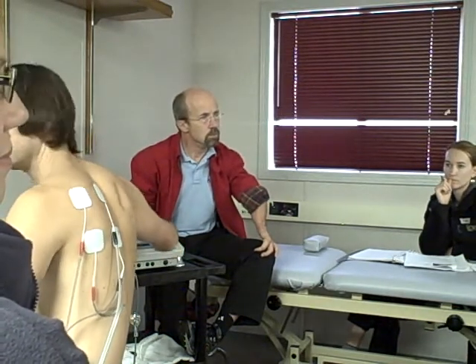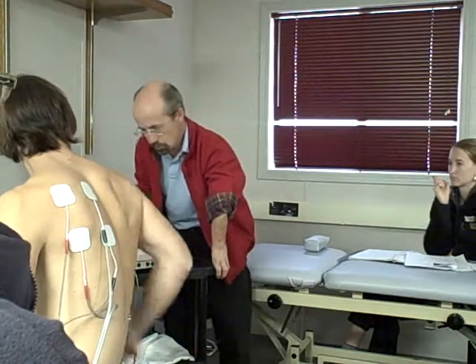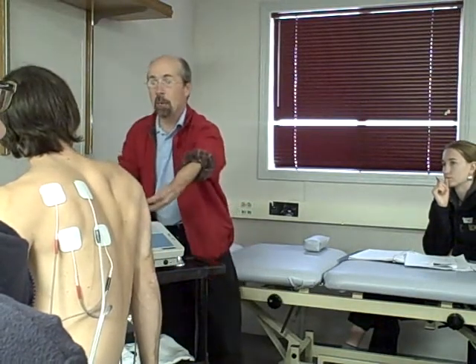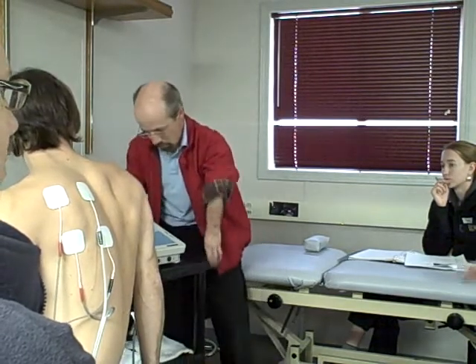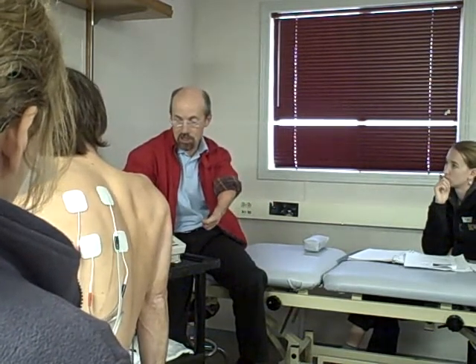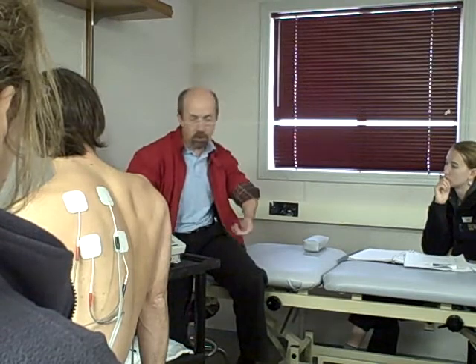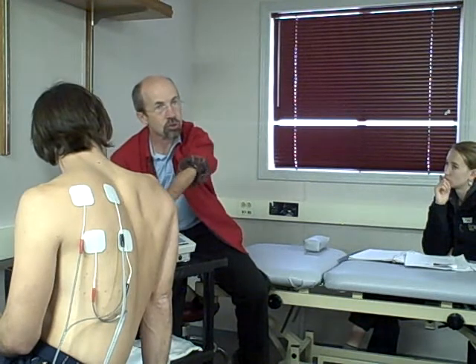Ours has two knobs. One opened up that ability for you to move the intensity between the channels. Stay with me. However, not to be mixed up with changing the balance, if you really did want to change the intensity on channel 1 or channel 2, then on this unit you just come down here, press channel 1 and change the intensity, press channel 2 and change the intensity.